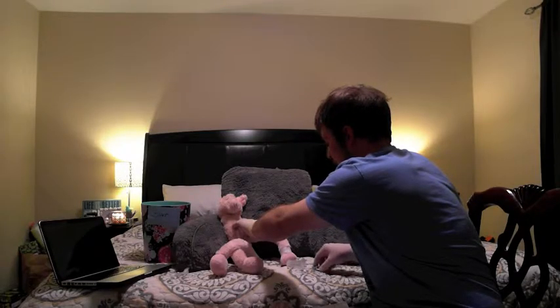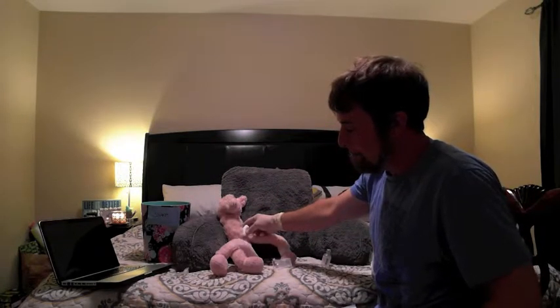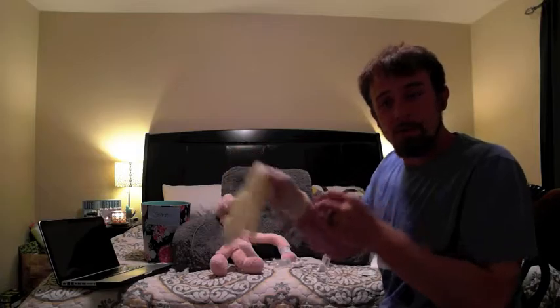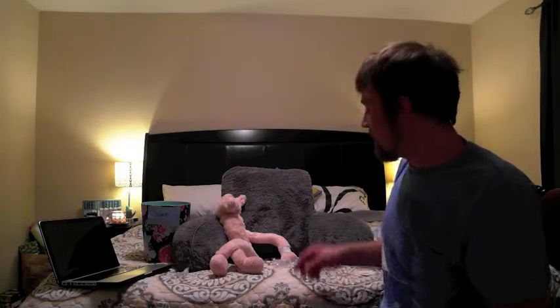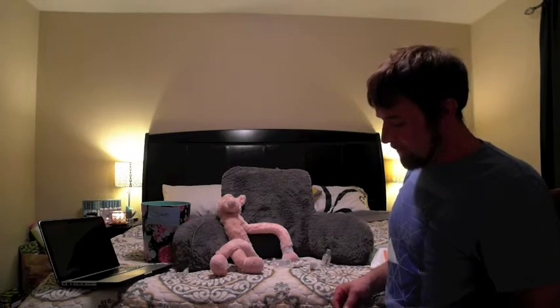I'm going to dispose of my needle in the sharps container. Finally, after all that's done, I'm going to take off my gloves, throw them in the trash, and I'm going to document that I gave Mr. Pink Piggy the flu shot on today's date and this time. And then I will sign, date, and add my credentials. And that would be the right documentation.